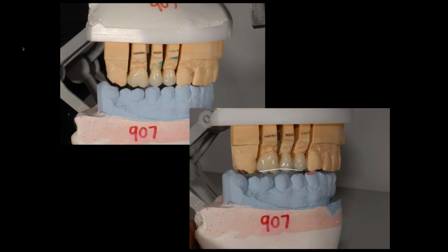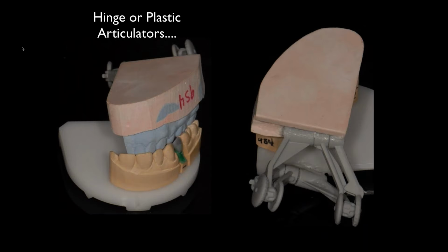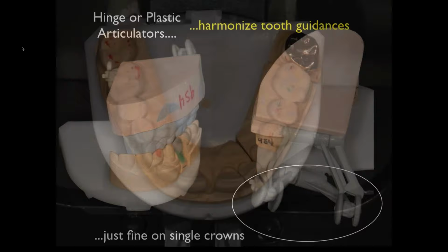So, particularly when we're doing more than one crown, it's really, really important we understand this and start considering using an articulator to help avoid these kinds of situations, okay? Because again, on these kinds of articulators, there's no function going on whatsoever, okay, in terms of physiologic function. It's all teeth just grinding along teeth, and we harmonize tooth guidances, which is fine, okay, as long as you know when you can do this and when you can't do this, okay.